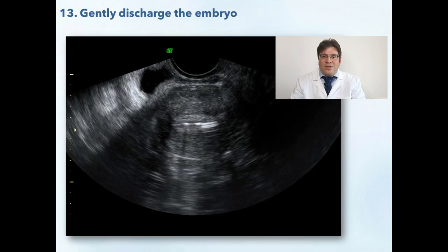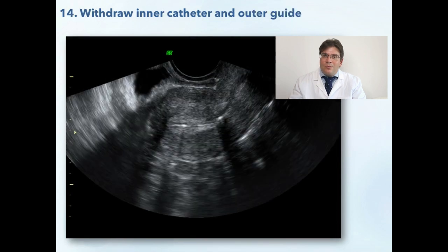Then, at the desired position, you could signal your embryologist to push on the syringe and gently inject the liquid containing the embryo. If the embryo is loaded with marker air bubbles, you should see them coming out. At this moment the procedure is finished and you could gently remove the outer guide together with the inner catheter and hand it back to the embryologist for inspection.